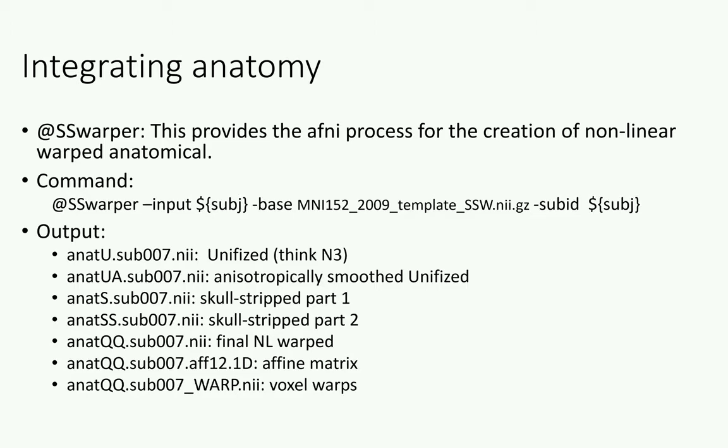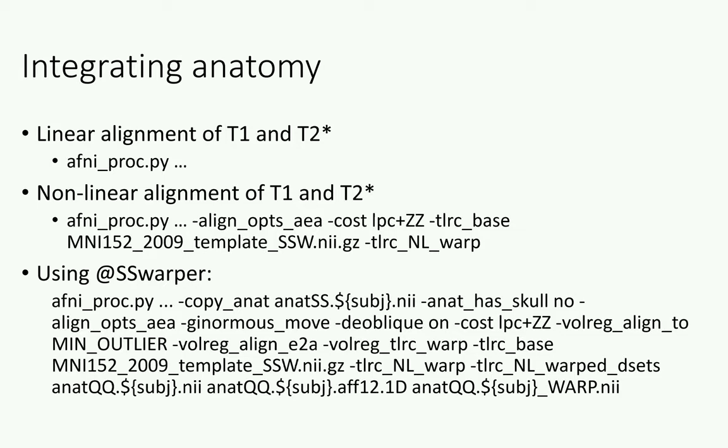We'll also apply various forms of skull stripping, which will be removing the data based on trying to find the surface of the brain and working our way through that. Then we'll have outputs, which will be actually the warping and the warping files. These warping output files are both useful for getting your anatomical now normalized or moved into MNI space, but also the path in which it was taken to get there. Those will be then utilized within your proc.py.